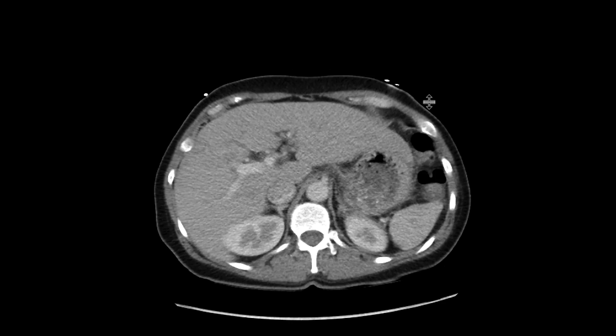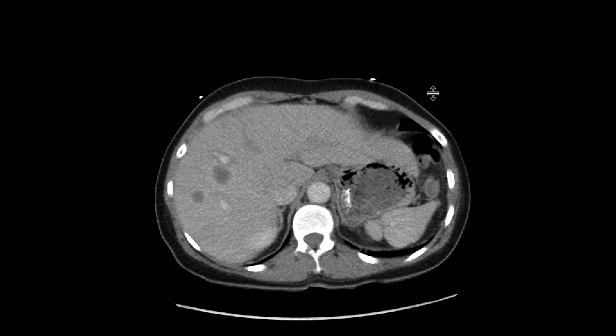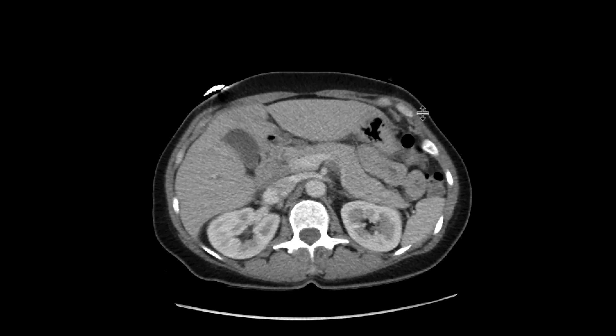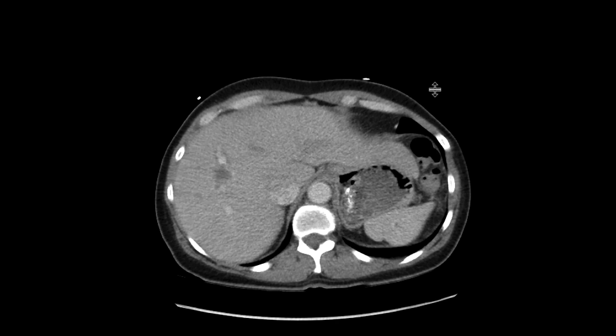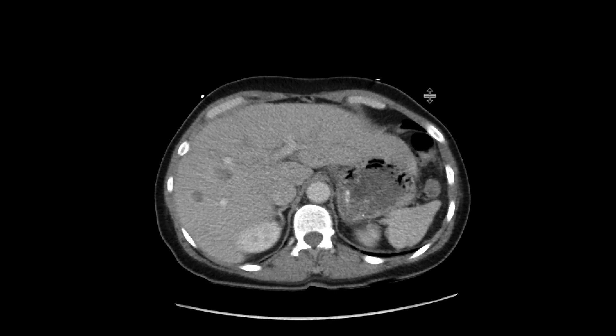They have some peripheral enhancement, and they are quite worrisome for metastasis, potentially abscesses, but there's not a lot of edema associated with them.